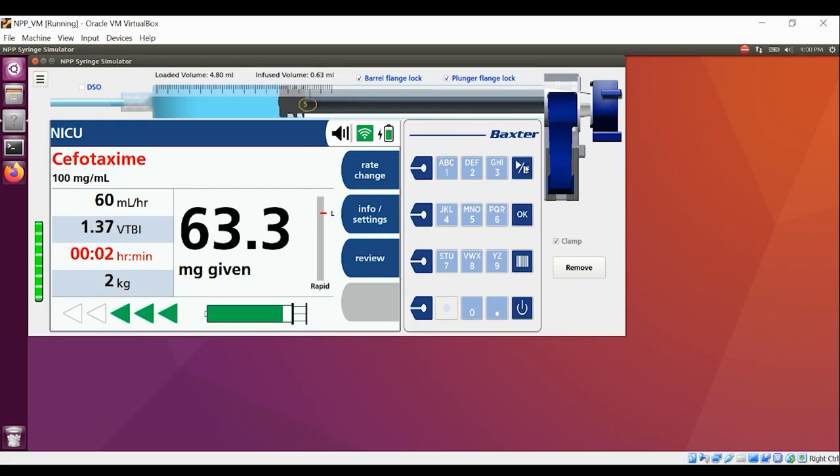Usual flush syringe sizes are 10 mLs or smaller, 5 to 10 mLs typically. Flush volumes are typically 2 times the priming volume of the set and any add-ons. Now, most users don't even know what the priming volume of their set is, so they estimate. So in the NICU, you may see a flush volume as low as 1 ml. Keep in mind that, depending on the length of that set and the priming volume, that may not be enough to clear the line. So 2 mLs is a good guesstimate, and I would use 2 mLs if I were you and doing a demonstration.